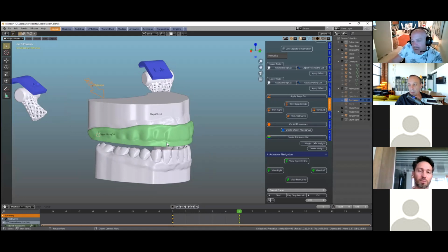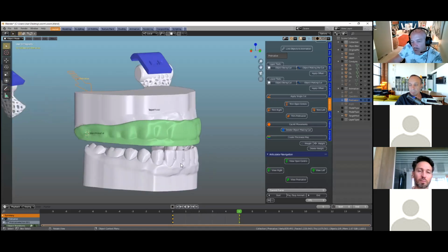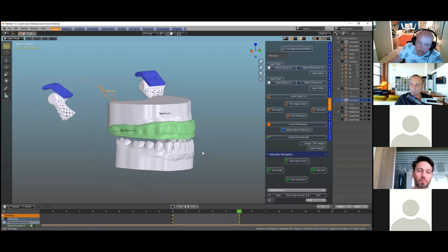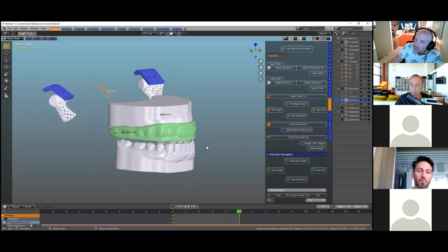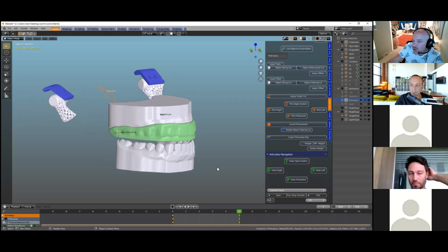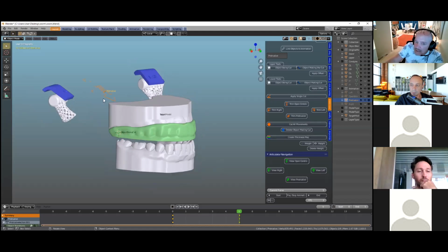In one of my videos I've tried to reposition the lower jaw according to this bite done outside, in the surgery. And we are very close, Wolfgang, except that when the lower jaw opens up and down, it also protrudes forward a little bit, which is not calculated in the articulator, unless we set it when we first start with the opening of the articulator.